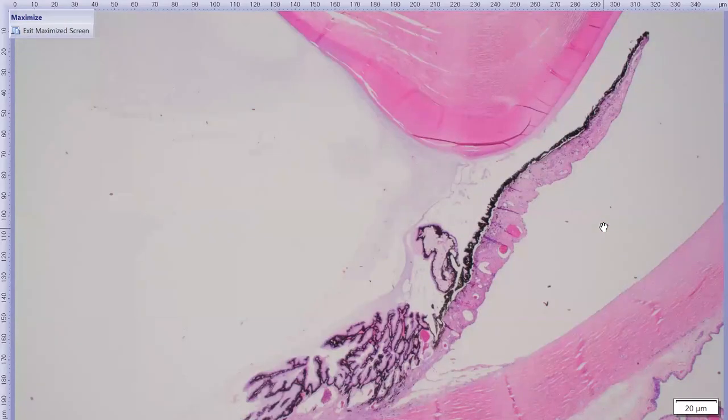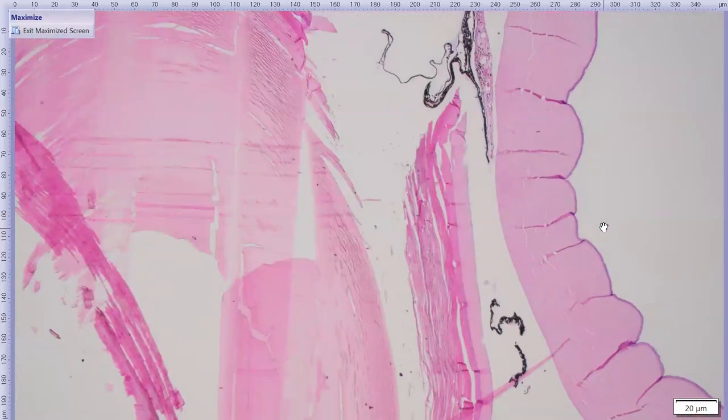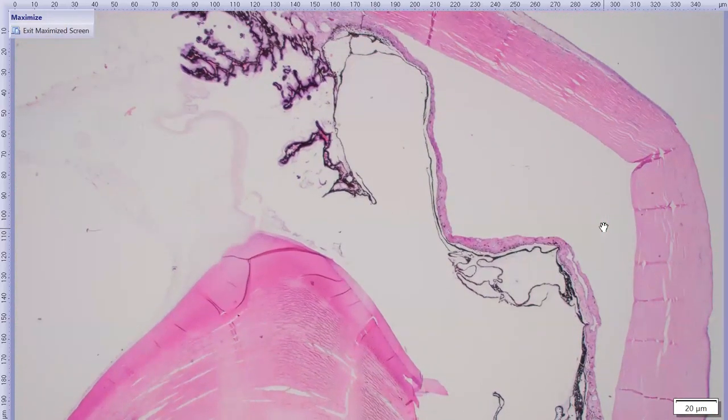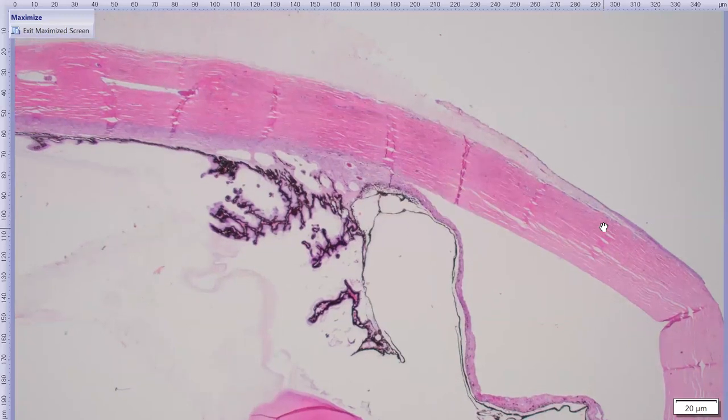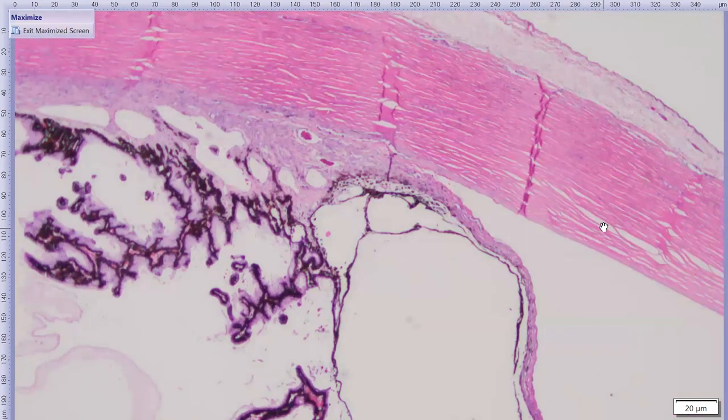So kind of an unusual cause of glaucoma in a cat, and then the added oddity of these uveal cysts and the dyscoria. And you can see on this side with this more elongate iris leaflet where the cysts are sort of the worst or most plentiful. On this side, the iridocorneal angle is particularly narrowed. So I would kind of wonder in this case what role the iridociliary cysts had or whether they had a role in the onset of glaucoma. Just sort of an interesting thing. Usually these sorts of things are incidental and don't cause any issues in eyes. So an unusual case of glaucoma in a cat.